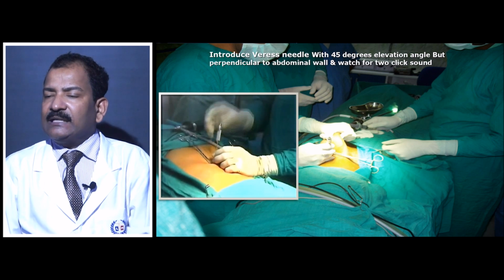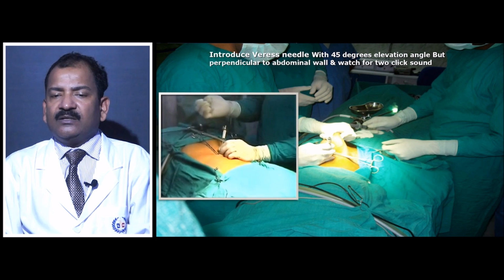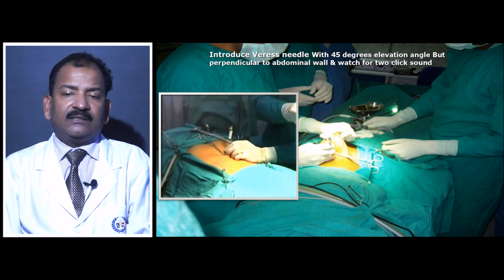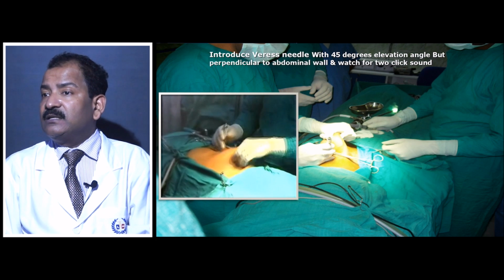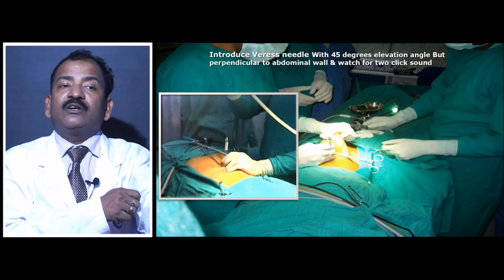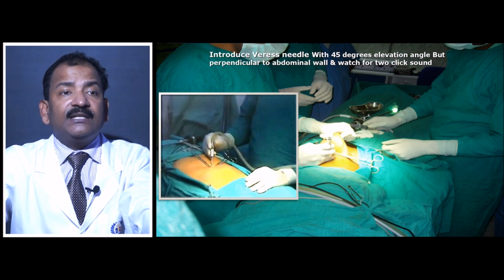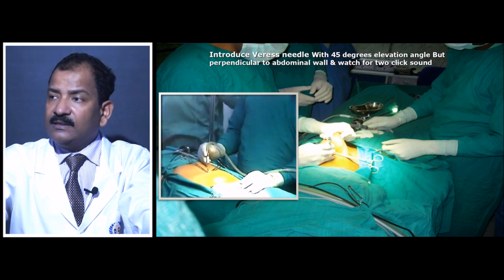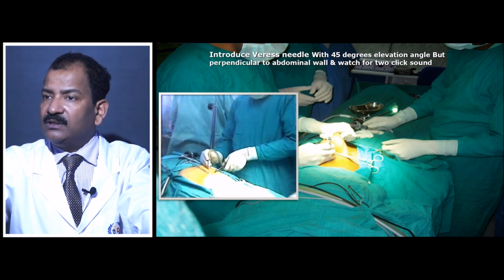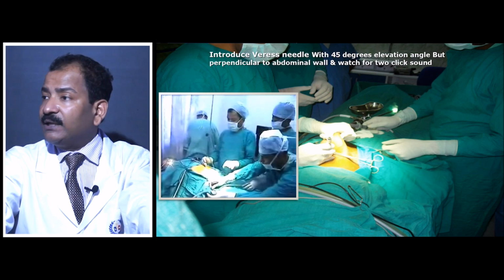Then you will do irrigation, suction and the hanging drop test. The hanging drop test is most important, which will let you know that you are inside the abdomen. As soon as you lift it, the drop will be sucked in, that means you are inside the abdomen, and after that you will attach the tubing of the insufflator. Once the tubing of the insufflator is attached, you will get a quadromanometric indicator, that is preset pressure, actual pressure, flow rate and total amount of gas used. This has a lot of information to let you know where your gas is going.